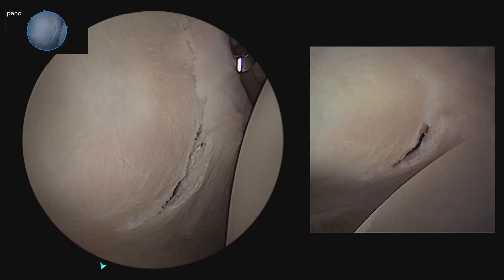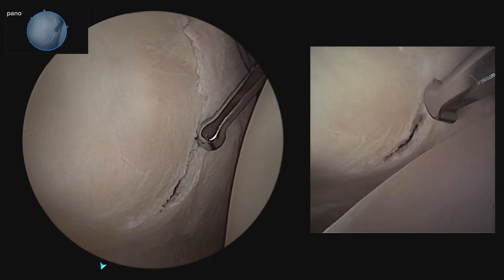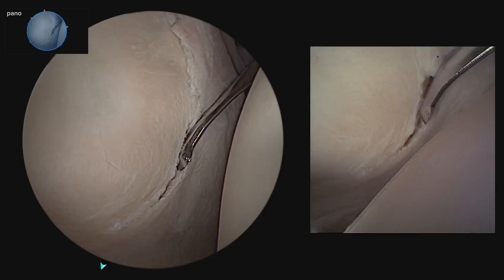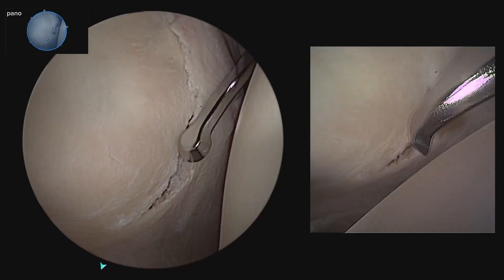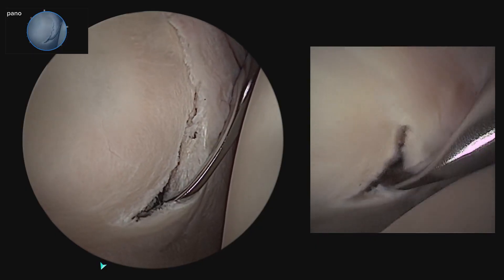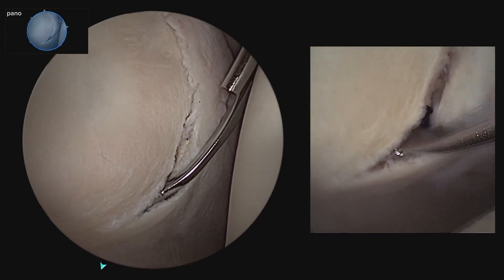Using the nanoneedle and the ASL portal, I look down on the Bankart tear so I can watch my elevator come in and free up the whole labrum from both directions — both from the posterior portal and then from superior to inferior. Using my elevator, I can free up the labrum and really make sure I am releasing all of the adhesions and getting the labrum very mobile prior to repair.